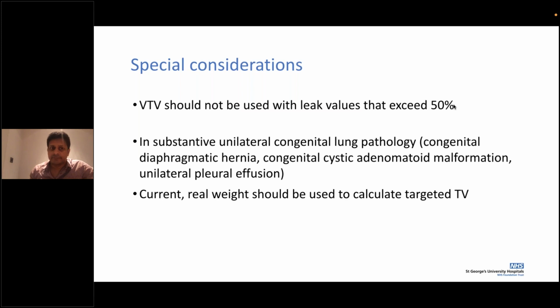Thank you. So if there is a leak in the volume control ventilation, if you have more than 50% leak, then you may need to change the mode of ventilation. Volume may not be the right mode of ventilation. Or for example, if there is a unilateral pathology like a CPAM or a pleural effusion, then of course the volume control may not be the right strategy.